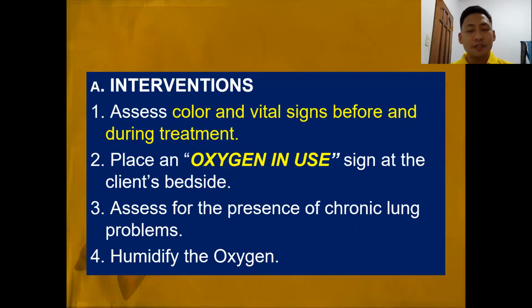And next is humidify the oxygen. Since we are administering continuous oxygen to the patient, unlike with our normal breathing, where we have a natural humidifier in the nasal cavity, in an oxygen therapy device it is artificial and it requires continuous oxygen administration. So it might cause drying of the respiratory mucosa.